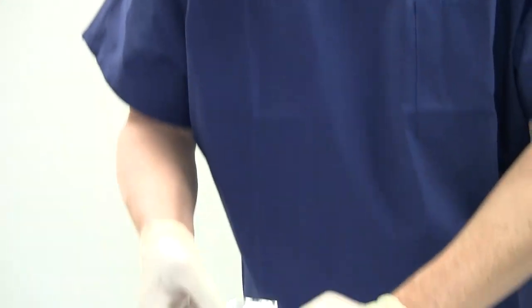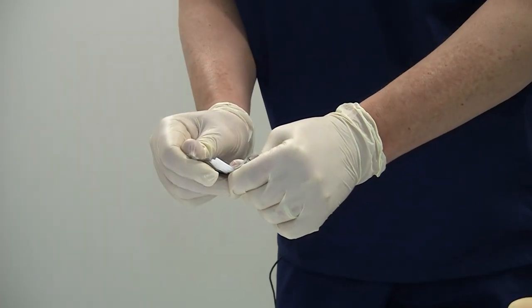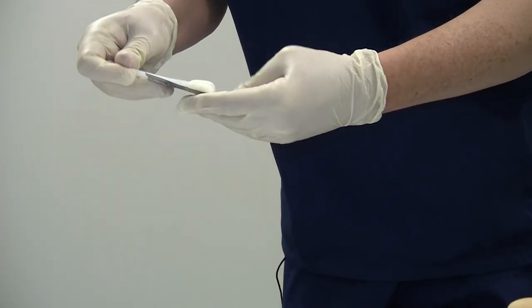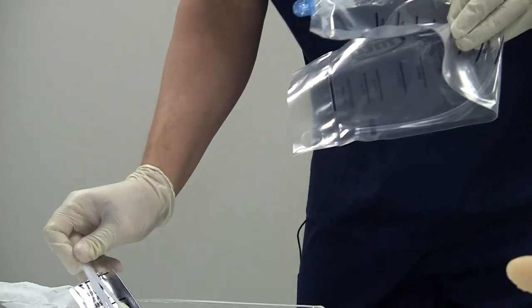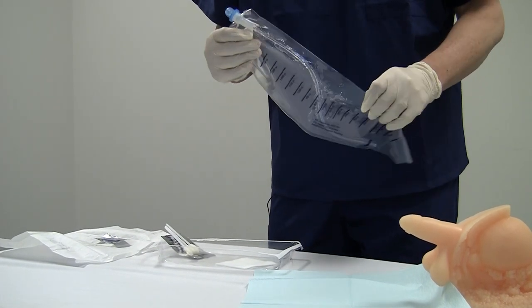Okay, the next kit component, after we've placed the underpad, are the benzalkonium chloride swab sticks. There's three of them in here, and these are our antiseptic. And you basically just tear the top of the package off and remove the three swab sticks. I like to just take them entirely out of the pack and set the pack right back in my sterile field. At the same time, I take the catheter with my other hand and remove it from the kit.